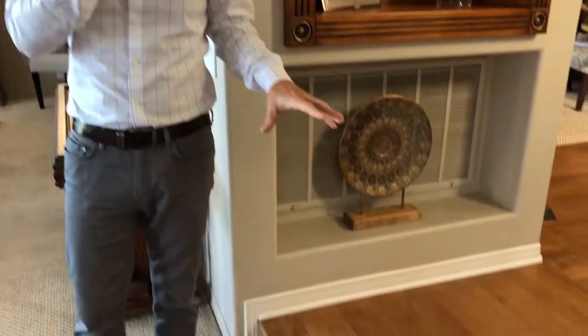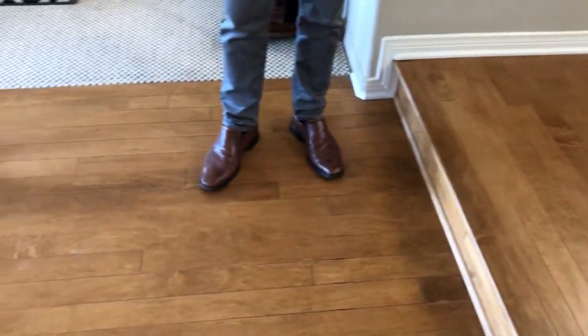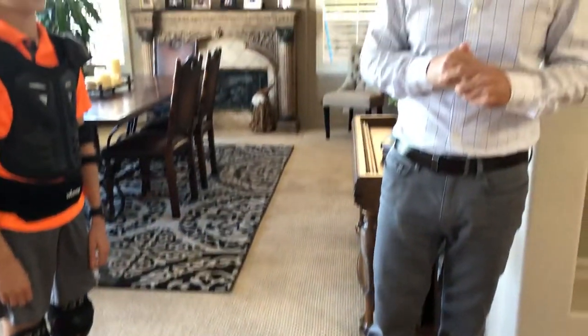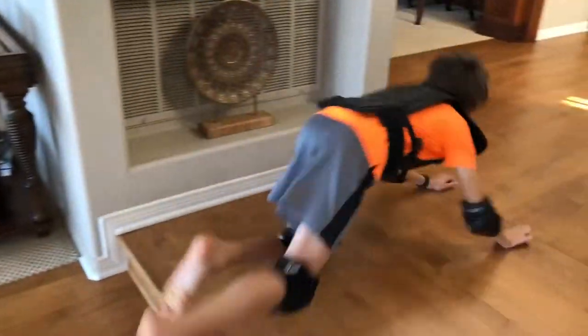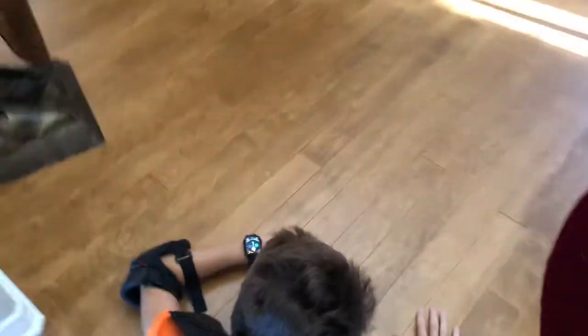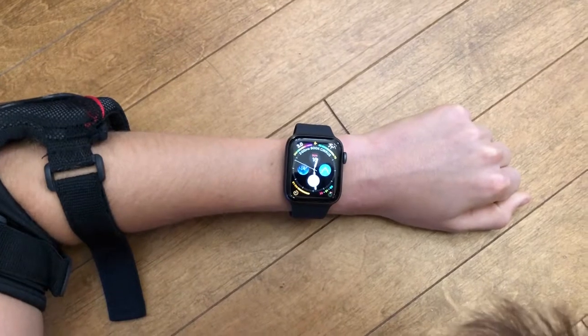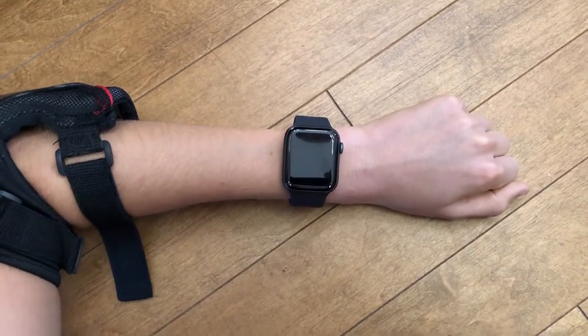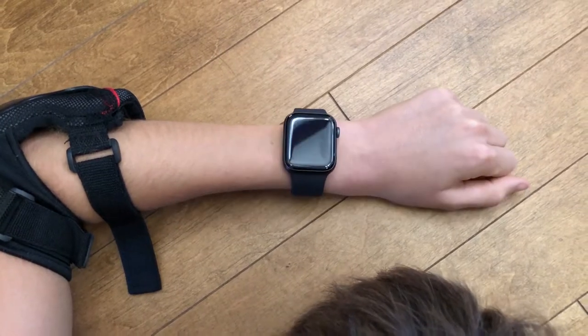This fall is actually going to be on a hardwood floor. This is a typical hardwood floor and could break some bones if an elderly person were to fall on it. So hopefully the watch is going to give us a detection. Andreas, go ahead — we're going to trip over the step. And we did not get a fall detection. That is a negative response.